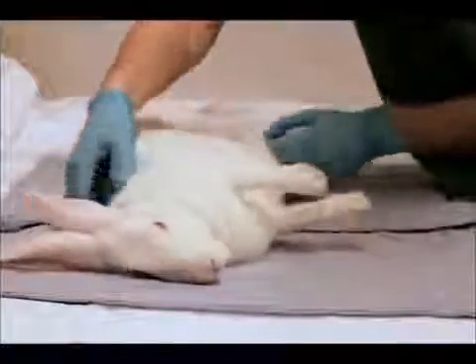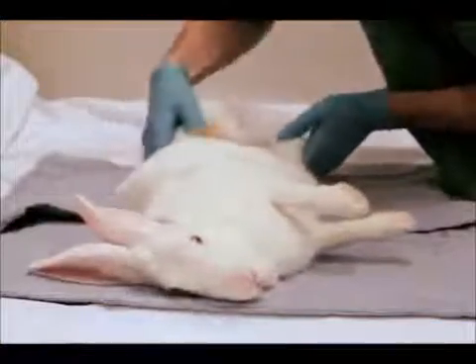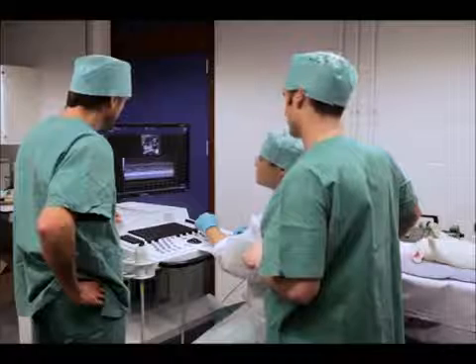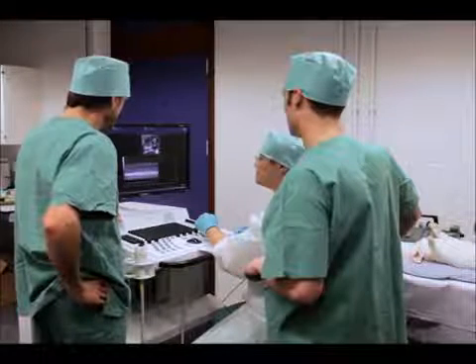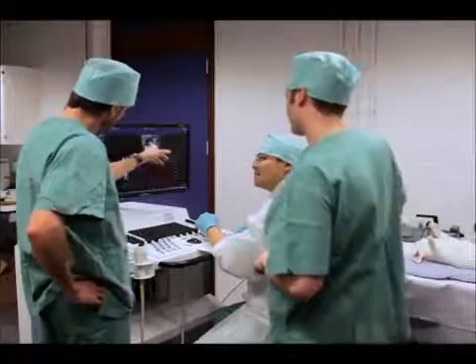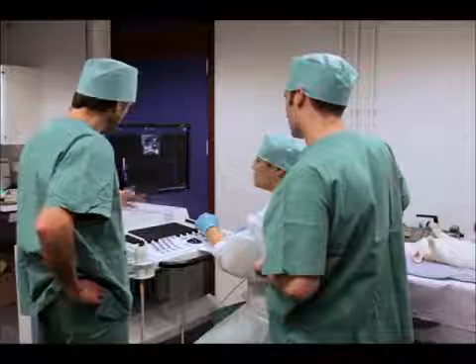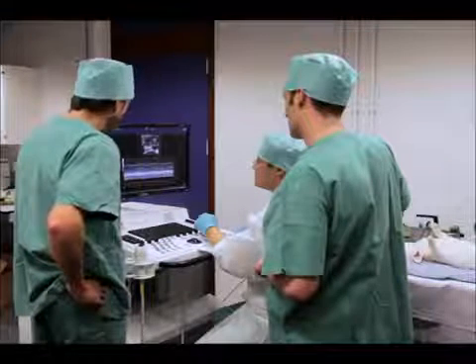At GA 30 days, place the rabbit on a warming pad for echocardiographic and ultrasound evaluation using the VisualSonics Vevo 2100 high-resolution micro-ultrasound platform with cardiac and strain analysis software. The system uses the VisualSonics MS250 transducer for data acquisition.